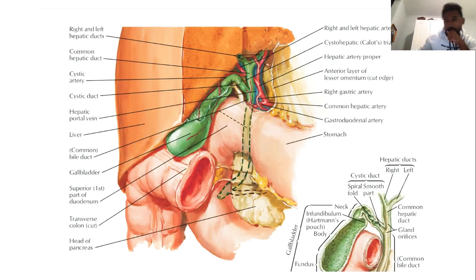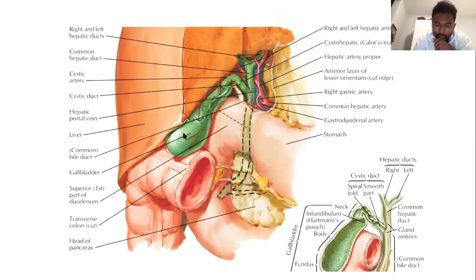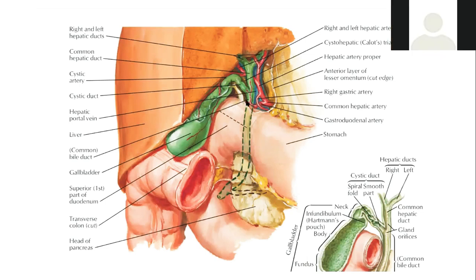So it's this area. Now, we did axial or transverse images of the gallbladder, right? We want to do a thorough exam. We want to look at this cystic duct, portal vein, this area. Let's say we bring the transducer along this way. Okay, we're not here anymore, we're here.